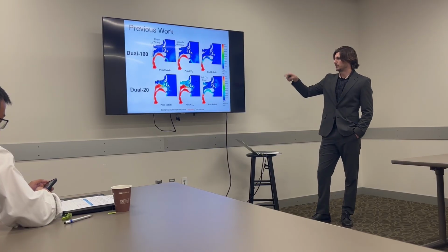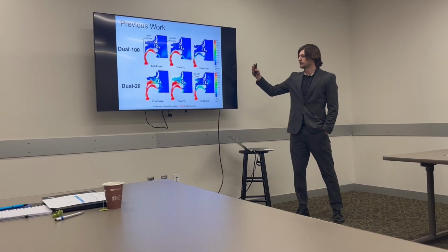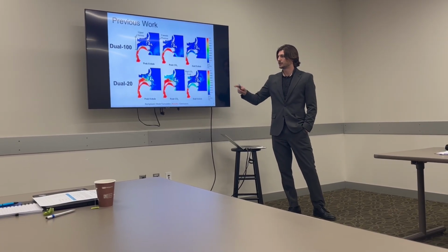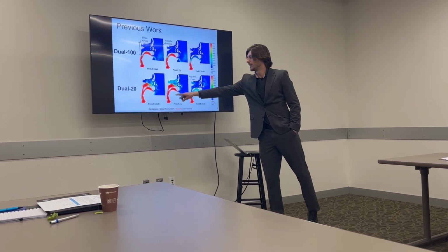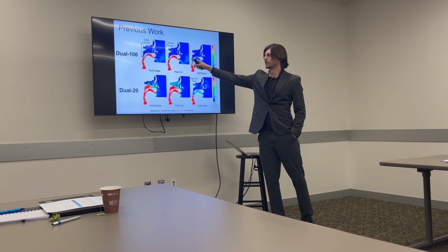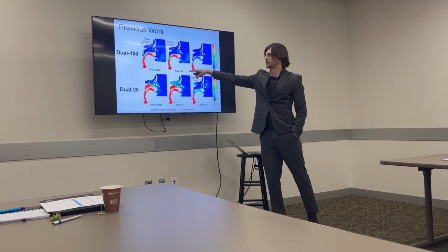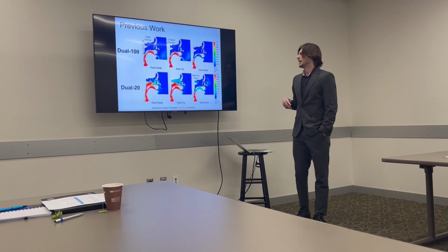Now, just to point out a couple important distinctions between dual 100 and dual 20. As we're closing the patient's mouth, you can see higher CO2 entrainment at peak exhale and peak CO2, where this red CO2-rich expiratory air is breaching the upper airway, whereas with 100% mouth open, that's all being redirected, evacuating out the open mouth.